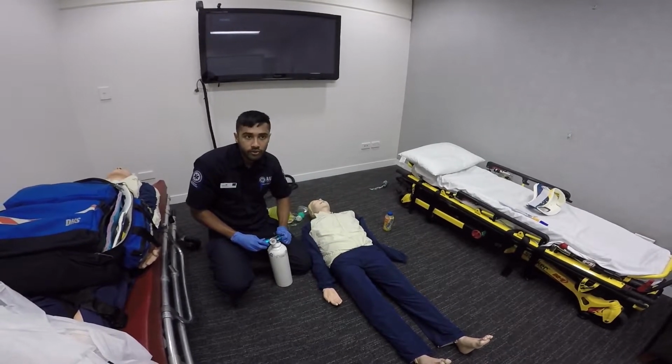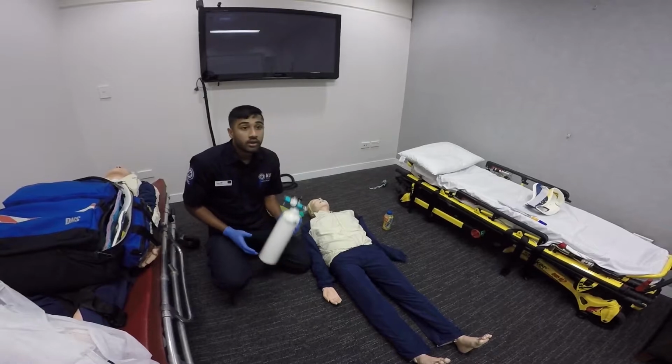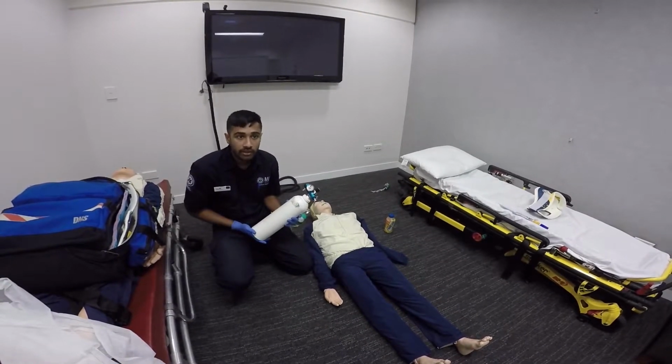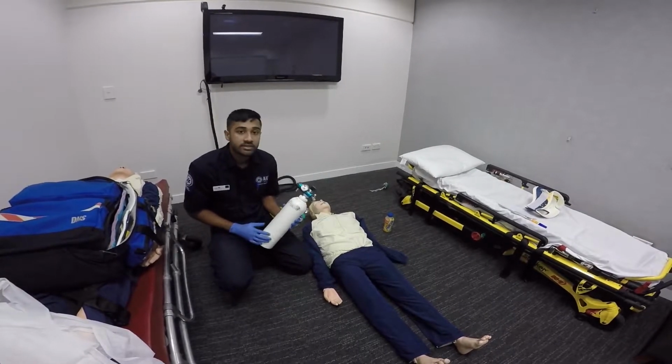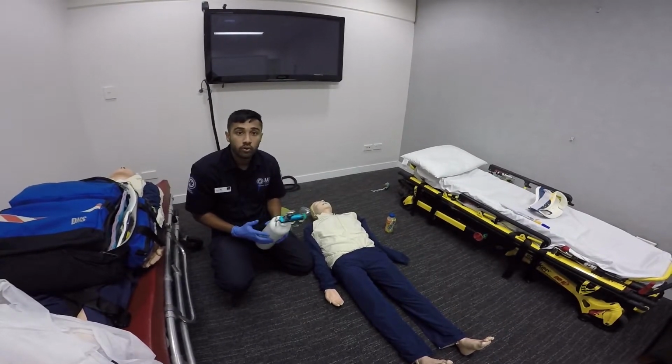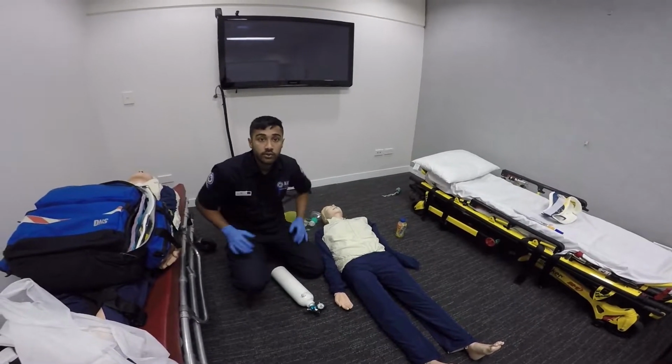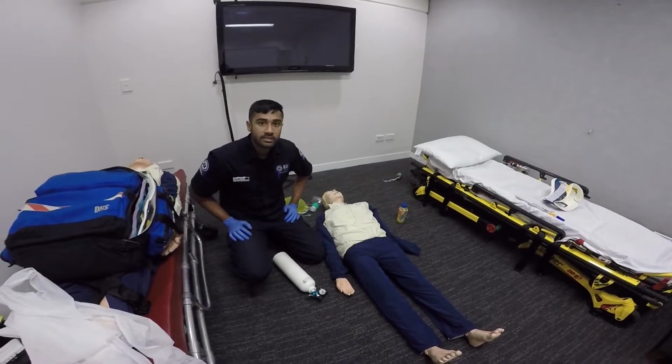And then you can do a quarter turn just to make it loose. Uses for oxygen can include respiratory distress, TBI, smoke inhalation and shock. And risks for using the oxygen is O2 or oxygen aids in combustion. So when we use the oxygen tank, we lie it flat so it doesn't move around or explode.